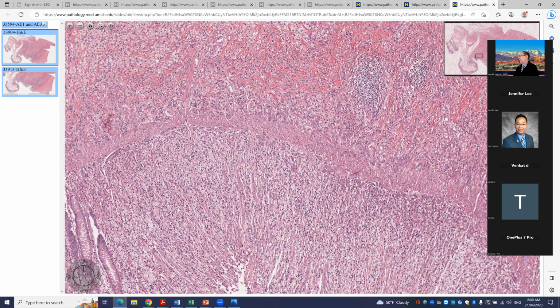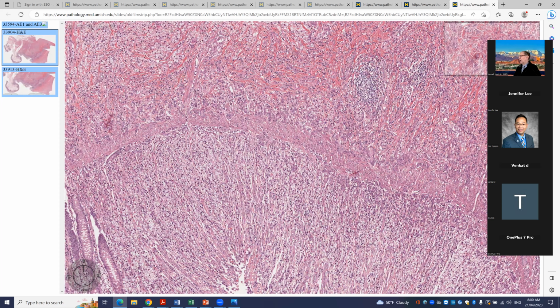Well, let me rush through these last two cases if we can, or at least the next one, to sort of round out the morning. Here. Well, it's not letting me open. So these are the DAPA cases.